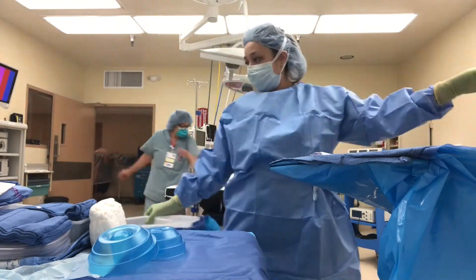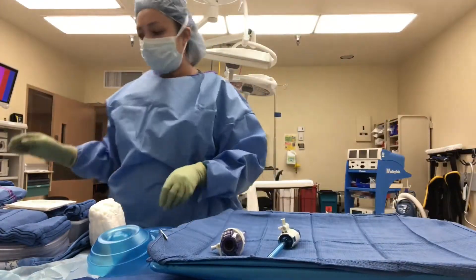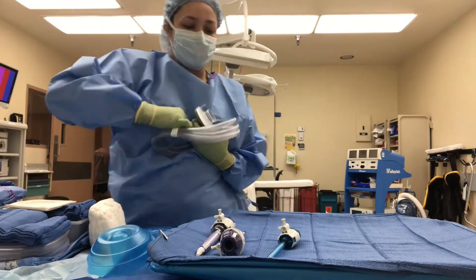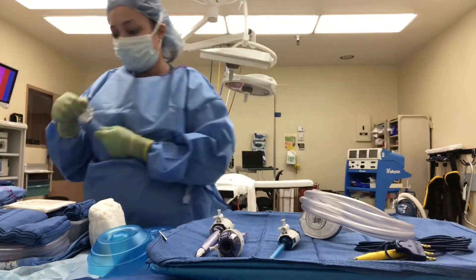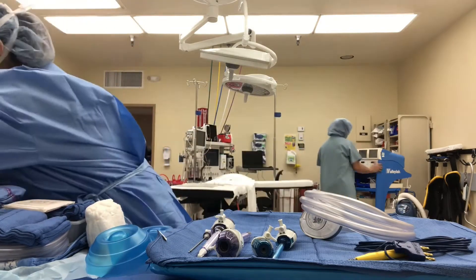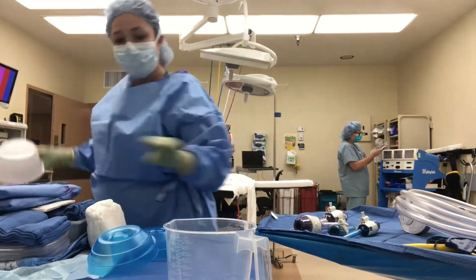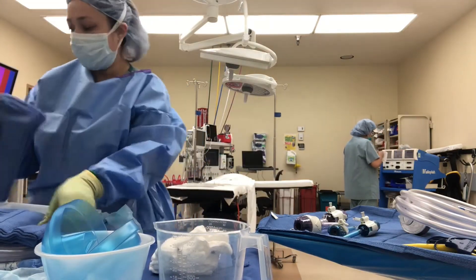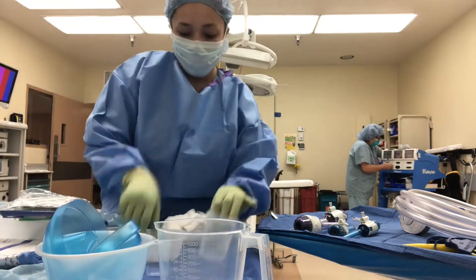Now setting up my trocars. There are both blunt and bladed trocars. Bladed trocars have a blade that helps puncture into the abdomen. Here's my insufflation tubing and my bovie, which is used to stop bleeding and also to cut through tissue. Insufflation tubing is used to get gas into the abdomen. We first insufflate before we insert any trocars, most of the time, unless the doctor is using an OptiView trocar so that we are sure we are not going to poke through the colon or any other organ.